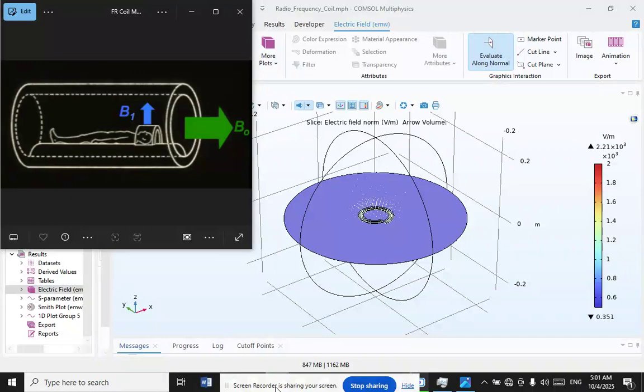The receiver coil picks up the oscillation at RF frequency produced by precession of the magnetic moment of nuclei inside the subject. The signal acquired by the coil is thus an induced EMF and is not the result of picking up radio waves. This is a common misconception and unfortunately has propagated through the literature. MRI scanners are generally situated in metal mesh-lined rooms which act as Faraday cages.